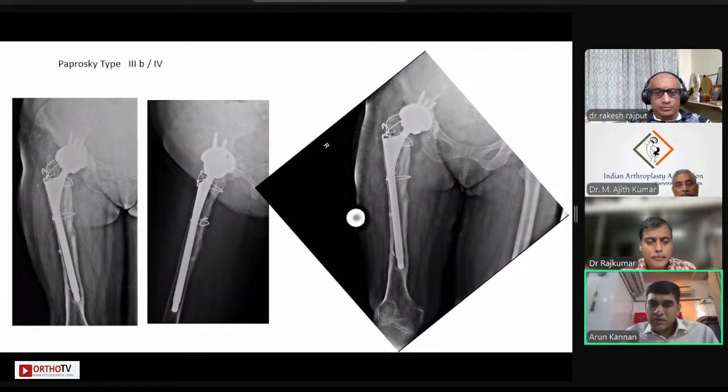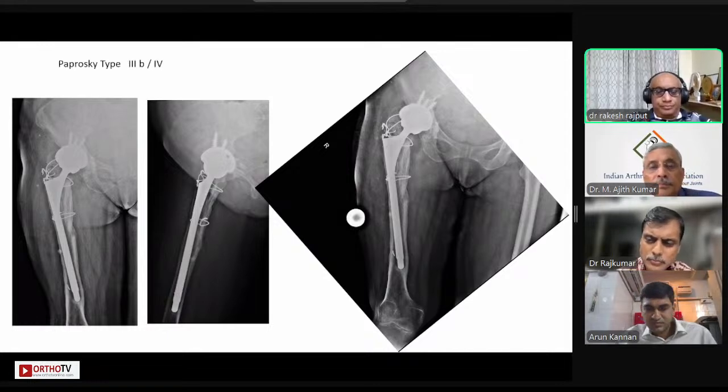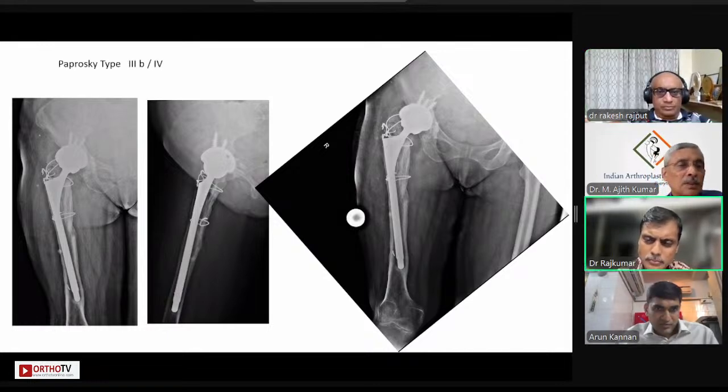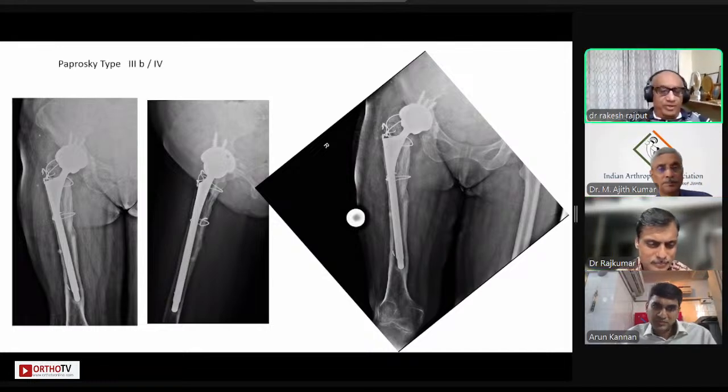So again, infection workup was negative. What would be the options? Luckily, that small isthmus bone is intact, the distal. But the entire lateral cortex seems to be gone, proximally near the trochanter, and in the metaphyseal region everywhere. I think they probably did an ETO, but somehow managed a combination of those fragments, and while wiring up, this bit completely disappeared.